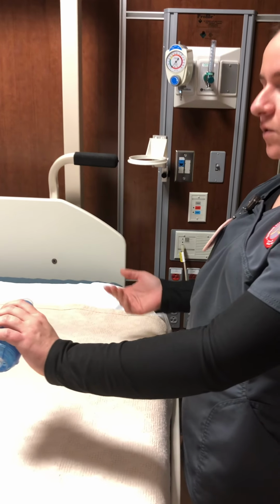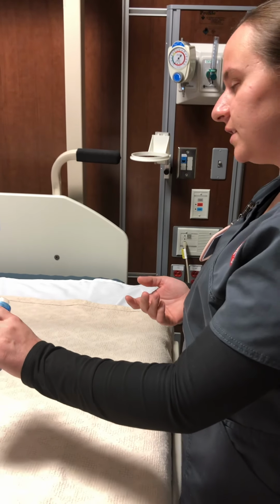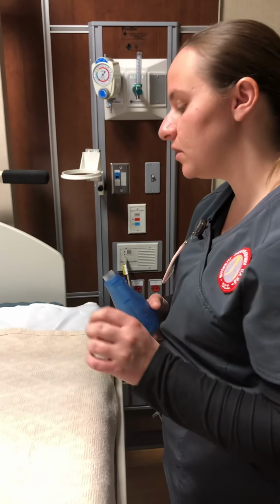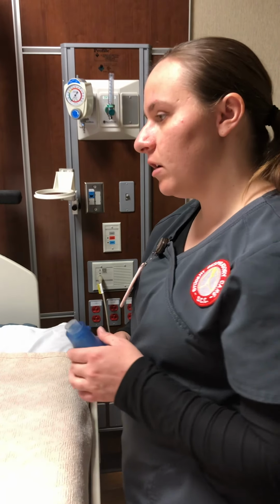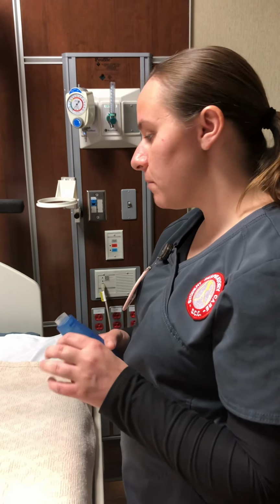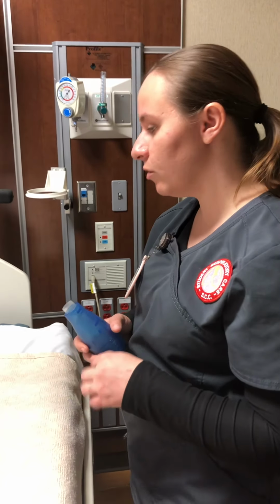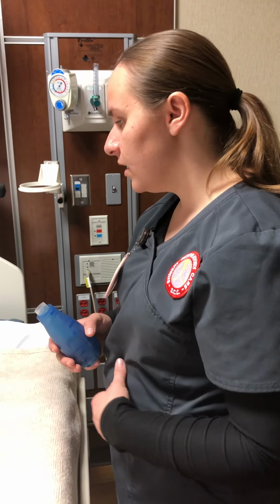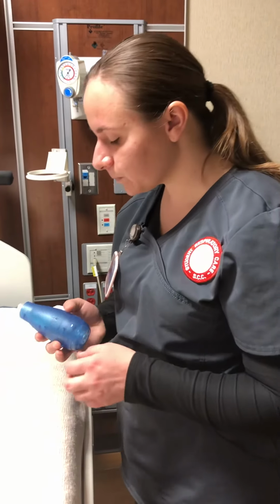Alright, so once we've exhaled, we'll do this about 4 to 8 times, for 10 to 20 minutes. That way we can get your lungs cleared. But if we can't do that many times, that is okay. We'll work our way up there, and we'll get your lungs clear and open, that way you can breathe better.